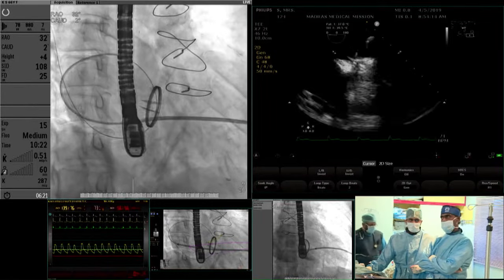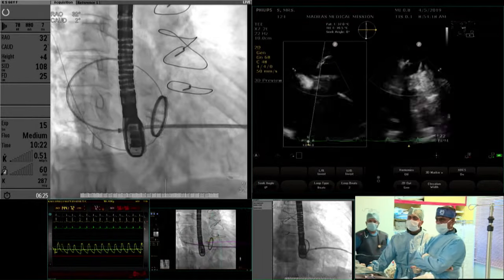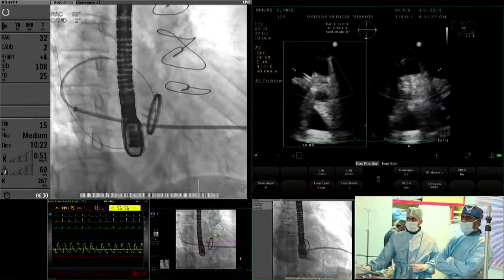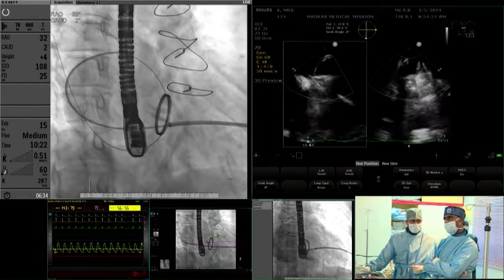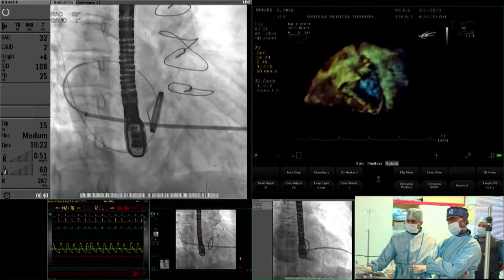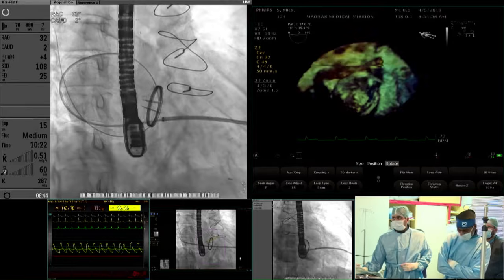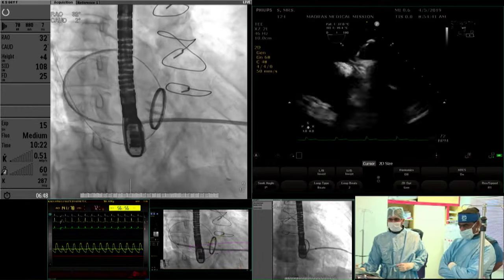Because it's a St. Jude valve, you want to make sure you don't have a big flange hanging over into the mechanism. Exactly. We don't want to trap one of the leaflets. That is one. And by the way, is Dr. Clare also there? So a VP3 probably is the sort of thing, because it's not quite round and that kind of oval configuration, probably good. A muscular VSD device, if it was really big, might be not a bad idea either.